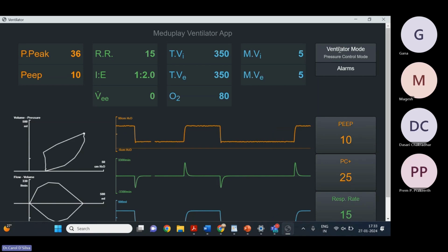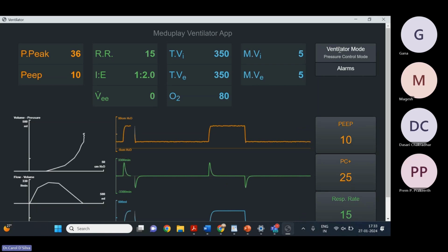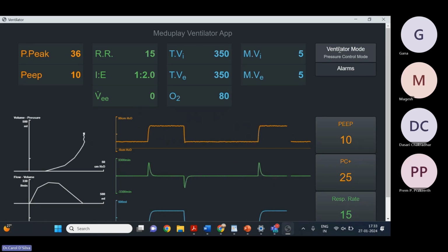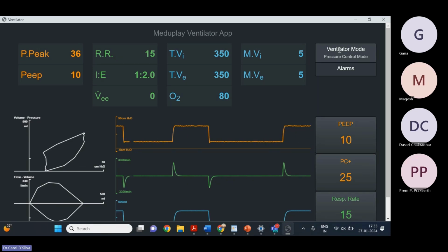So what is basically happening is in pressure control mode, you're setting a delta P. You have to set the trans airway pressure or transpulmonary pressure, right? So you have to create a positive pressure at the mouth opening. It is assumed to be 0. Now, if you've kept PEEP, then it will be the PEEP value. If you've kept a PEEP of 5, because that's the pressure that you wanted to keep in the alveoli at the end of expiration, that's what PEEP means. So if you put 20 minus 5, that is the pressure gradient that you are setting.